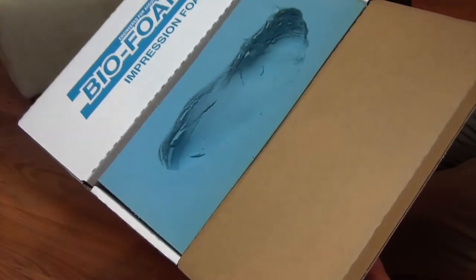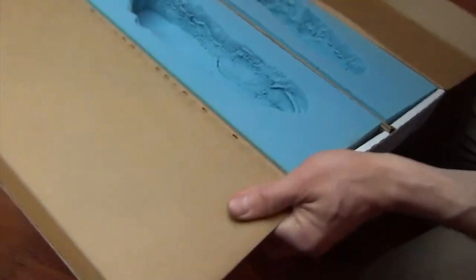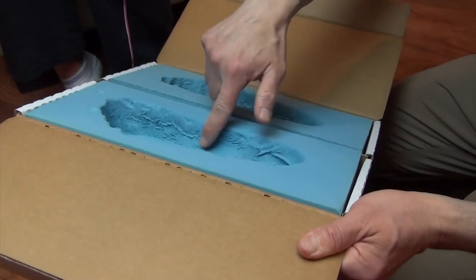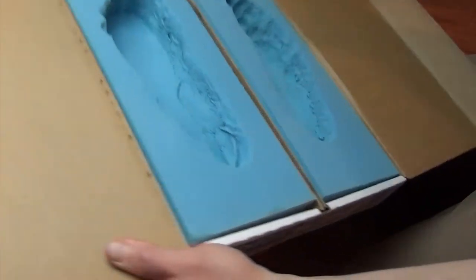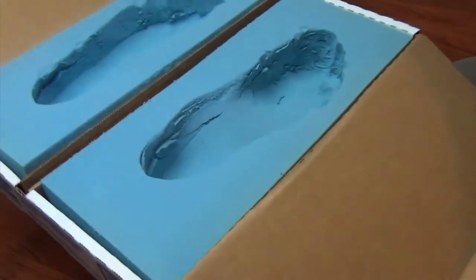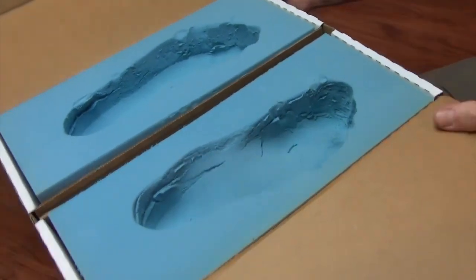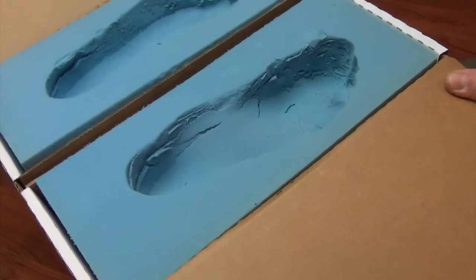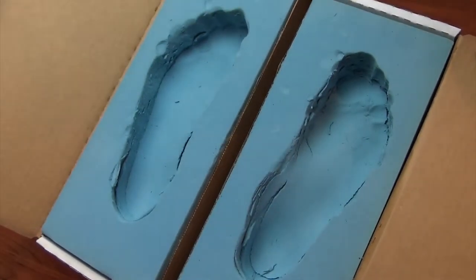Now I'll compare that to the other side — the left foot where this individual stood. Look at how the arch is all the way down; the arch is not up. Whereas on the right side, the arch is all the way up. And this is done on the floor, so you have the arch all the way up on the floor. That is what is key here.